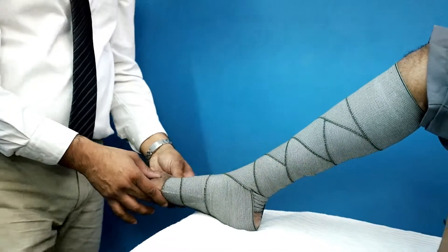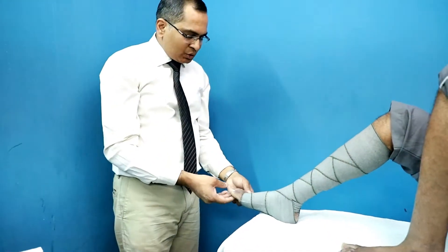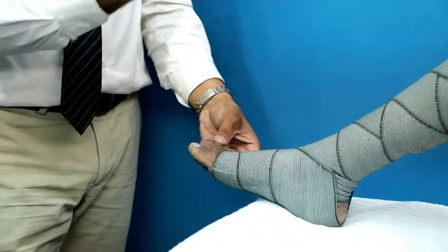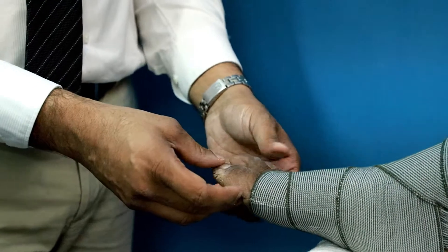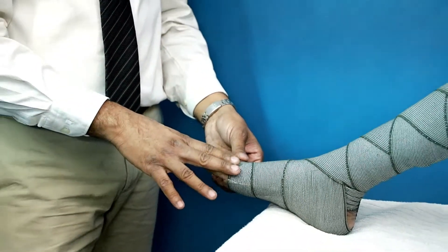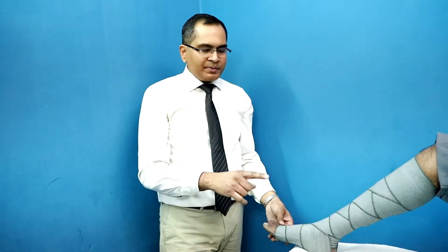After the application of this compression bandage, we need to check the circulation in the toes. We need to see whether there is capillary fill in the toes or not. We need to ask the patient whether he is comfortable or not. If the patient is having pain in the toes or is not comfortable, then this needs to be taken out and the pressure needs to be re-adjusted to the extent the patient is comfortable.